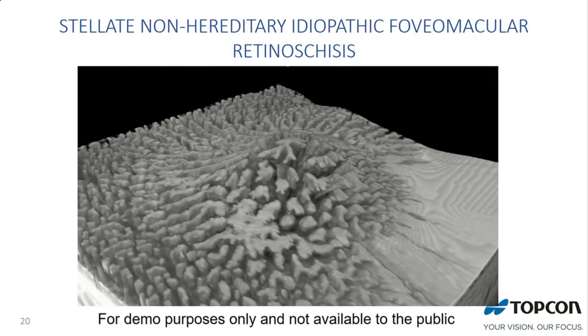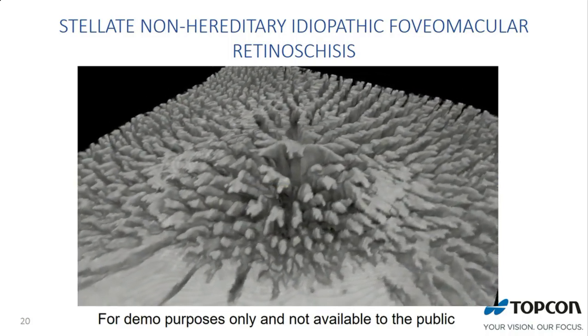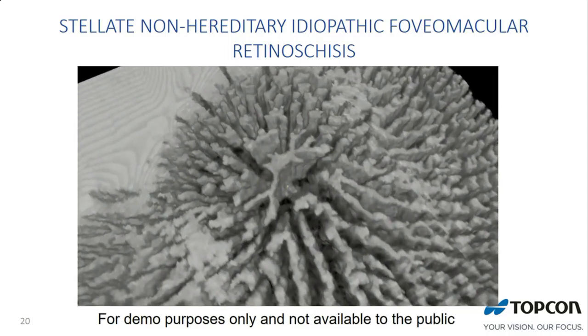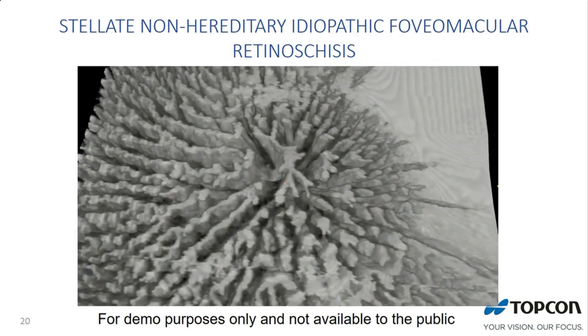So this isn't on the instrument, but I use it to visualize the benefits of using the data set. And here you can see how these columns connect up and down, and you can see why the visual acuity is so high in this patient.